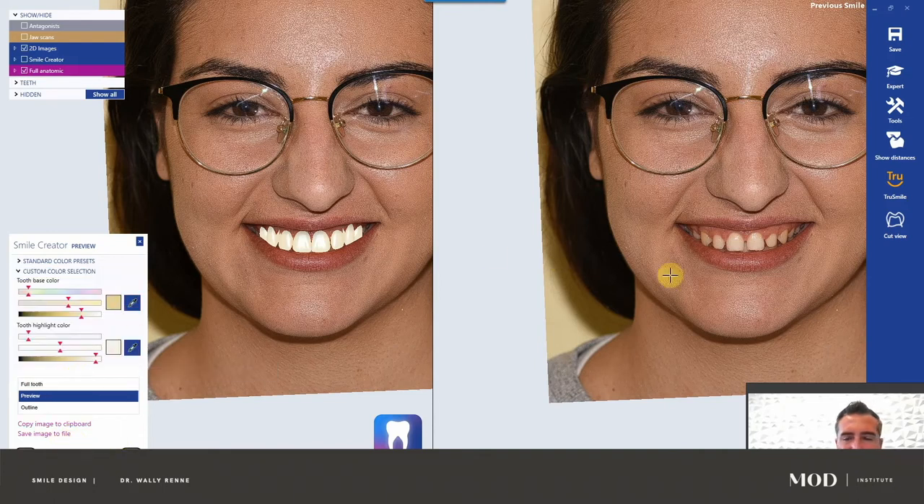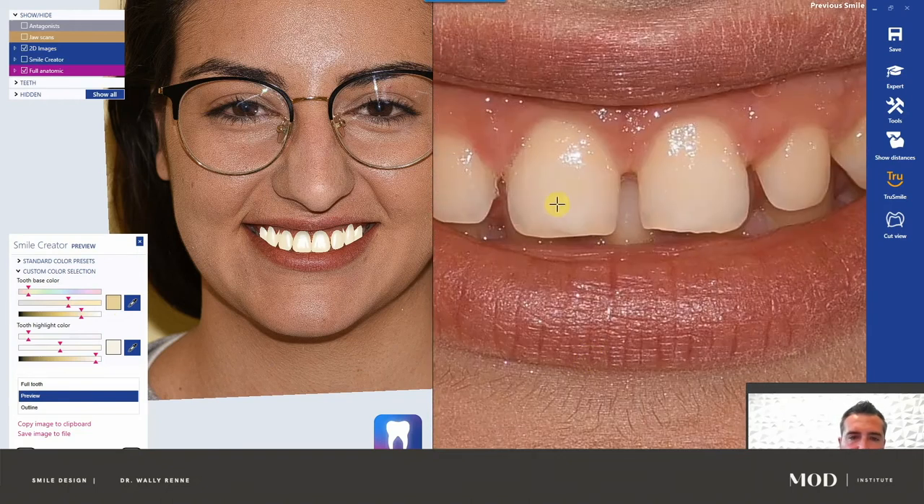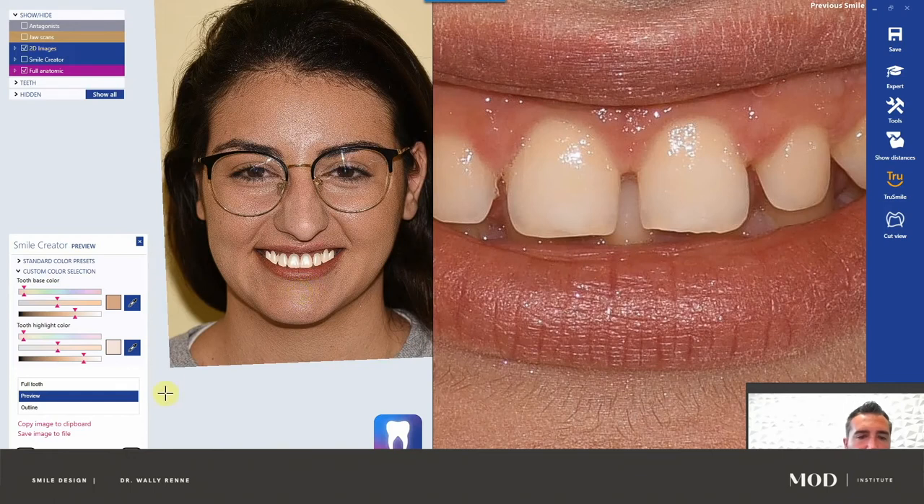I don't like how weird and yellowy it looks, so I'm going to use custom color selection. With custom color selection, it asks you to find the highlight and the lowlight, the base color — click the dropper. You want that to be something kind of dark for lowlight, and something bright for highlight. Then you could change the chroma intensity, alter the amount of yellow, the amount of chroma, change the value. The relative brightness is down here, chroma is up here, and this is your base color.